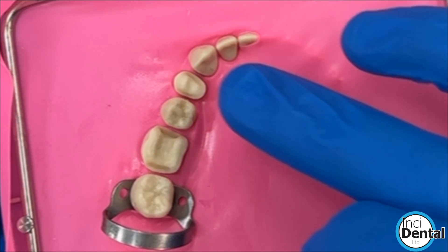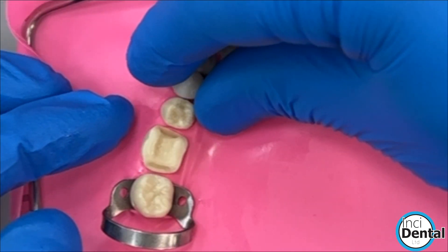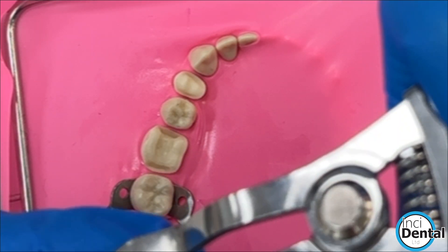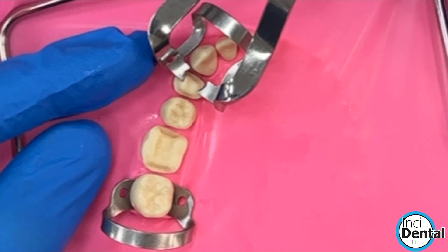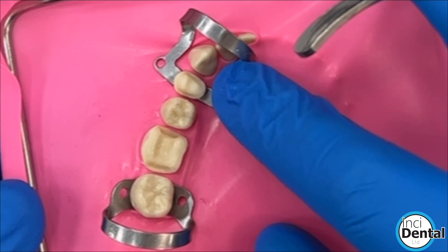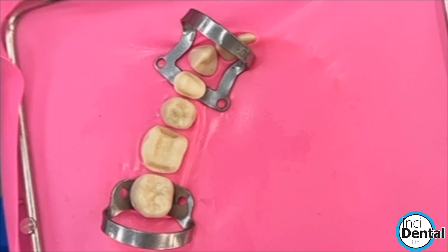Just to show some variety, I've put in the overlay that we cement on the course, so that's all ready to go for the delegate so we can walk through all of the process. You can see the OC clamp works really well on premolars and all the teeth really. The way those tines engage lets it sit lovely and flat, so you can get the floss right down and clear those contacts and make sure there's no resin between the teeth, which is absolutely critical.